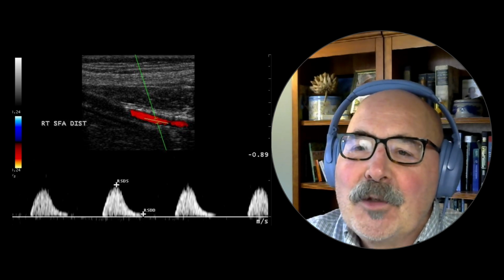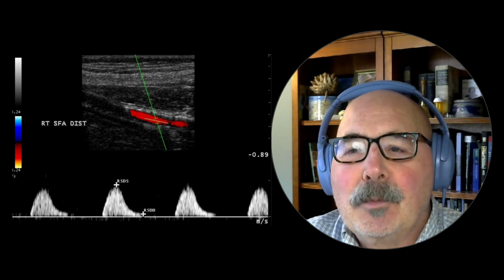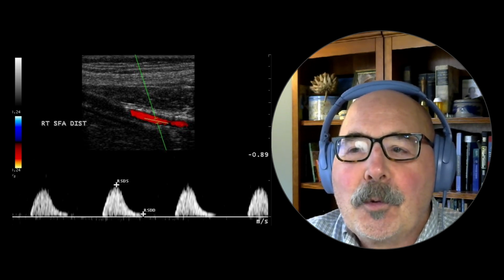And as always, physiology first. All arterial duplex studies should have a physiological correlative study.